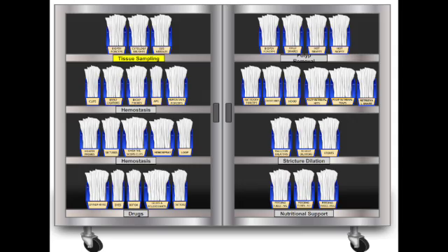First, hemostatic spray or hemospray. Right, hemospray. Think of this as a temporary fix for widespread bleeding. It's a powder you spray onto the bleeding area. How does it work? It absorbs water, concentrates clotting factors, and forms a kind of mechanical barrier. It's especially useful when the bleeding is too diffuse or too brisk for standard contact methods like clips or probes, or maybe the location is just too awkward. It buys time. A temporal safety net.